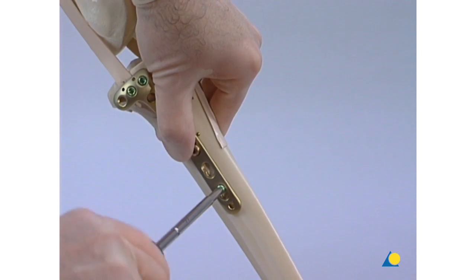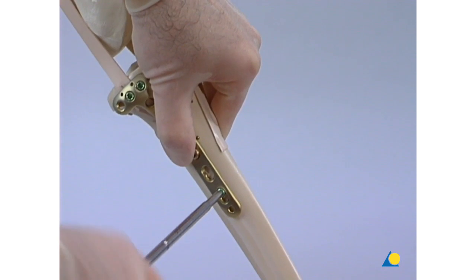Finally, another locking head screw is inserted through the most distal plate hole.